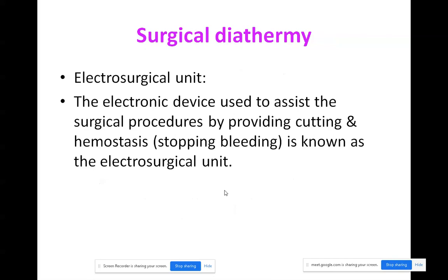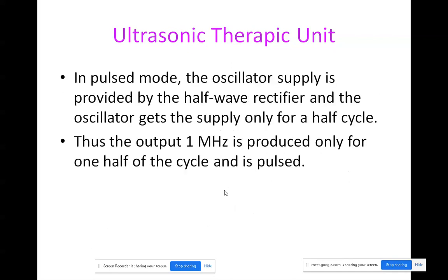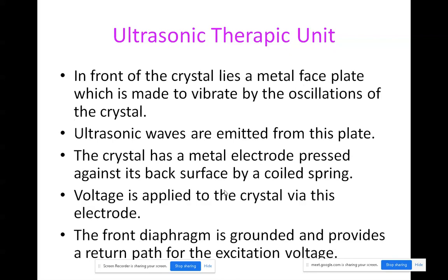So next we go for surgical diathermy. That's all about ultrasonic diathermy. Most ultrasonic diathermy techniques or types will be avoided because of the dosage control problem as well as the physical damage to the part due to uneven areas or wounds in the body.